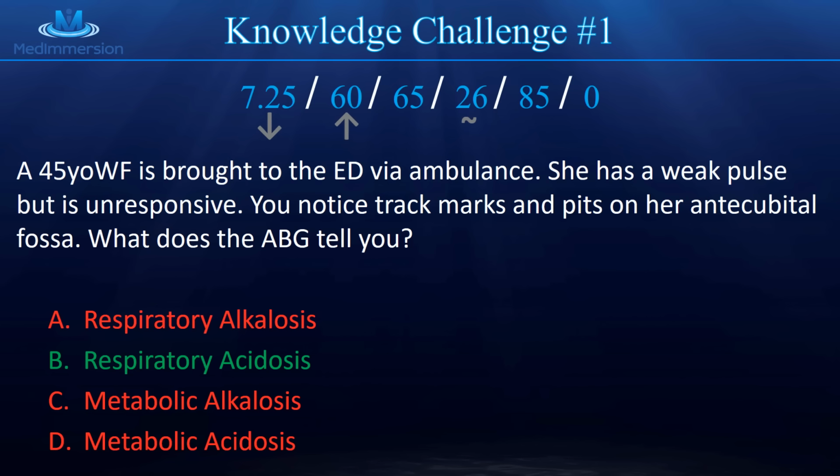Her breathing reflex has been subdued via the drugs. What about the compensation? Well, in this example, I didn't put the bicarb above what I consider to be a normal value. I put it at the high end, but not above, because she hasn't been overdosing long enough for her kidneys to compensate. But you could say that they're starting to because that value has risen. Okay, good job. Let's try the next one.